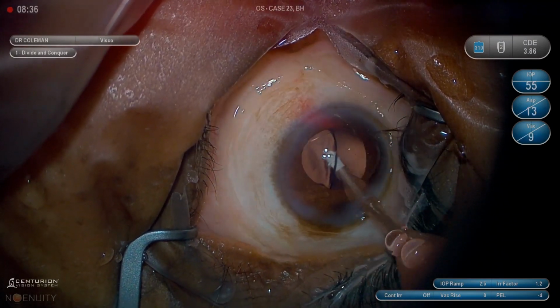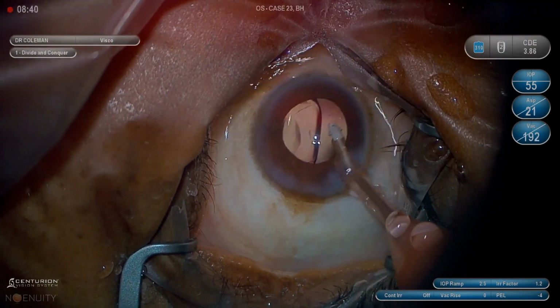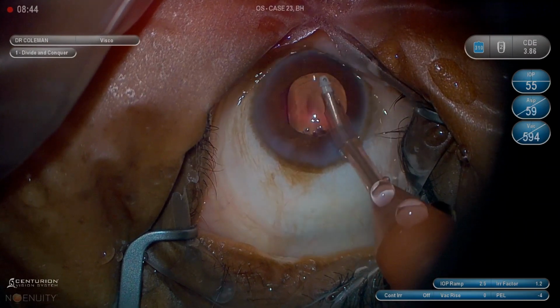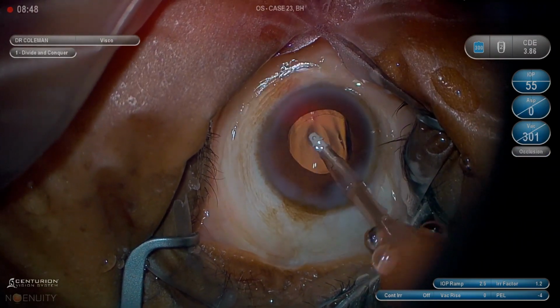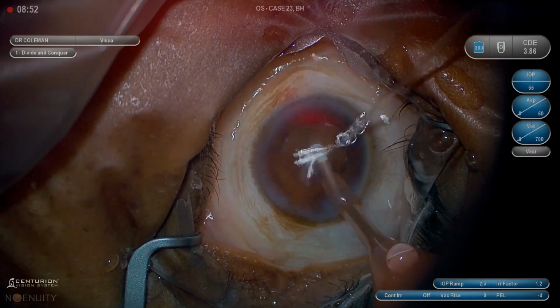So here we're going behind the lens, centering the lens back up by just pushing down on the center of it. These optics are pretty tough. This works well even with the light adjustable lens. It works fine. We'll have a separate video up at some point rotating toric lenses into the proper position, but it's similar to what we were just doing.